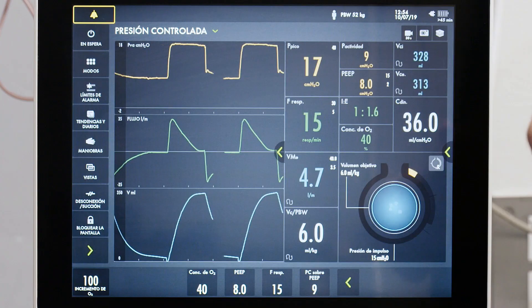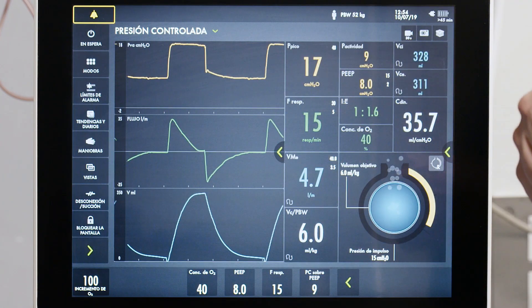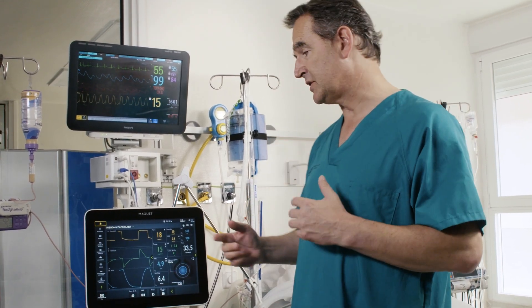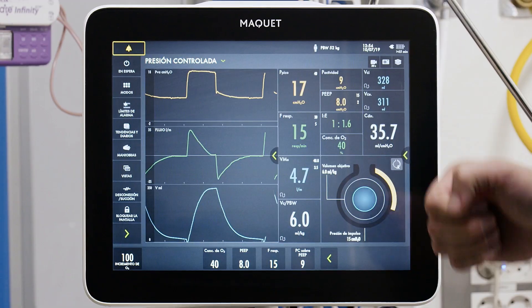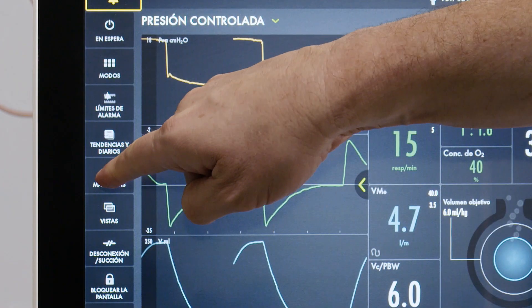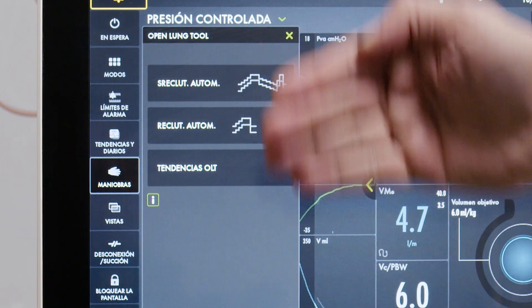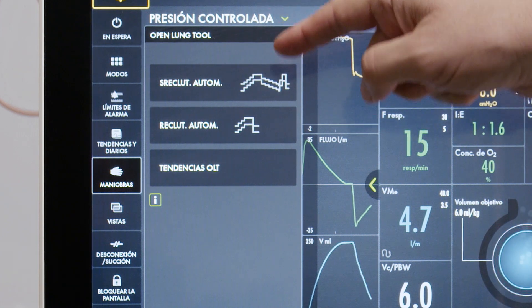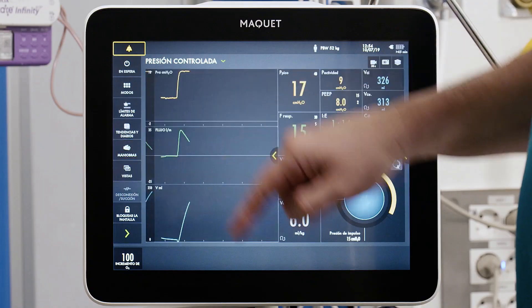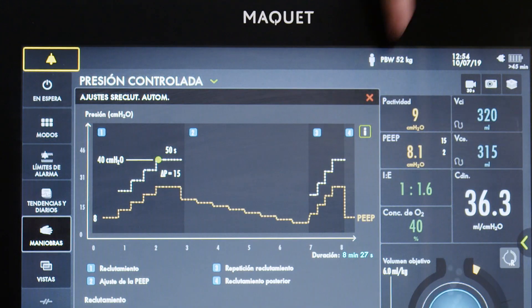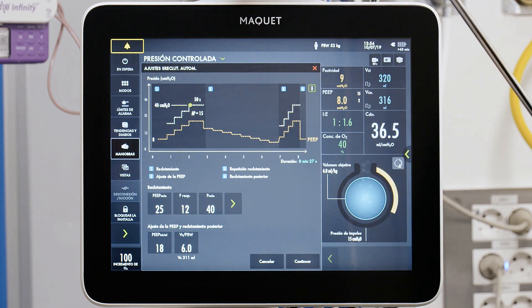We are now going to apply a lung-protective ventilation strategy based on the open lung concept. For this we will use an automated recruitment tool called the ASRM — Automatic Stepwise Recruitment Maneuver — which is software installed in the ventilator. To access it, we press 'Maneuvers,' then select the ASRM sequential recruitment maneuver.